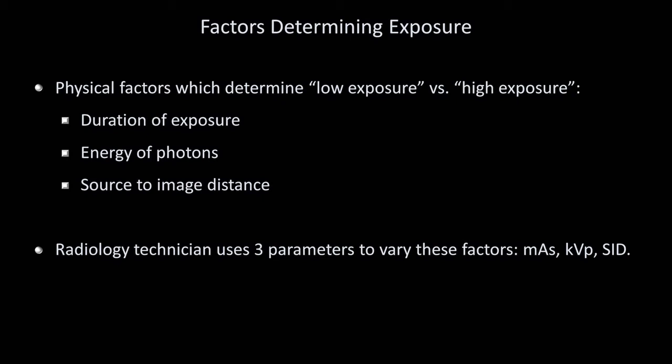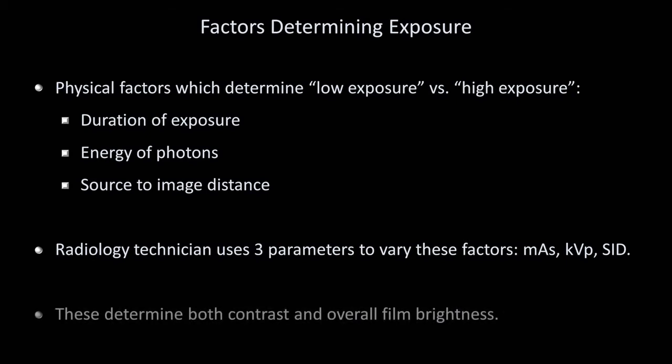upon the situation. The specific combination of parameters will result in a specific amount of brightness, sometimes referred to as optical density, and the amount of contrast. The technologist has a good deal of control in varying these parameters in different situations, such as extreme body habitus or an unusual SID. However, in general, they should be kept as consistent as possible from one exam to the next for the same patient. Otherwise, clinicians would not be able to tell if changes that occurred from one X-ray to the next were due to an actual change in clinical status, such as increasing or decreasing pulmonary edema, or were due to difference in radiographic technique.